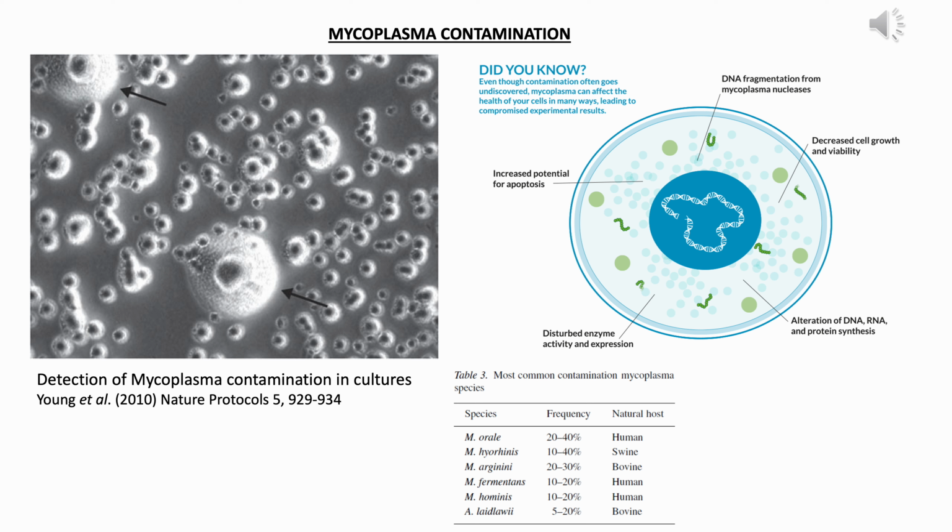Okay. Mycoplasma are the smallest self-replicating bacteria. They are less than 0.8 micron in size and they can pass through a 0.45 micron filter. So that's why I said if you want to do media sterilization by filtration, the pore size should be 0.2 microns or less. The most common of the mycoplasma that one sees in labs is Mycoplasma orale.